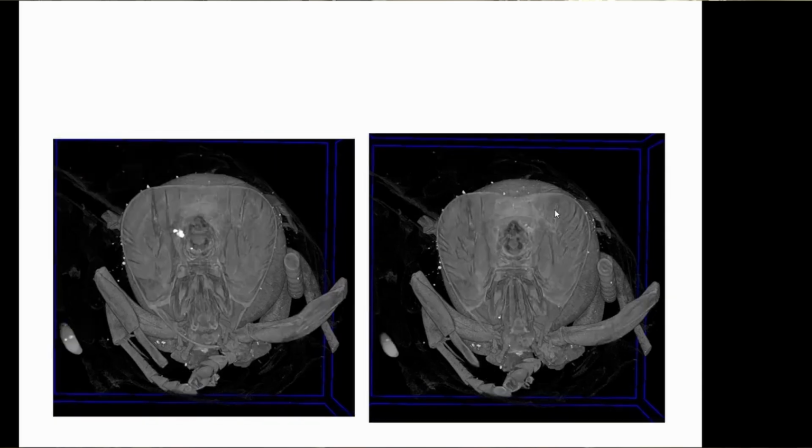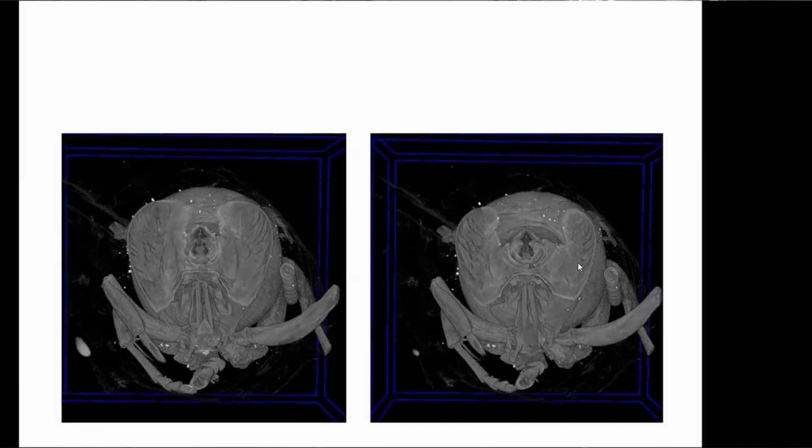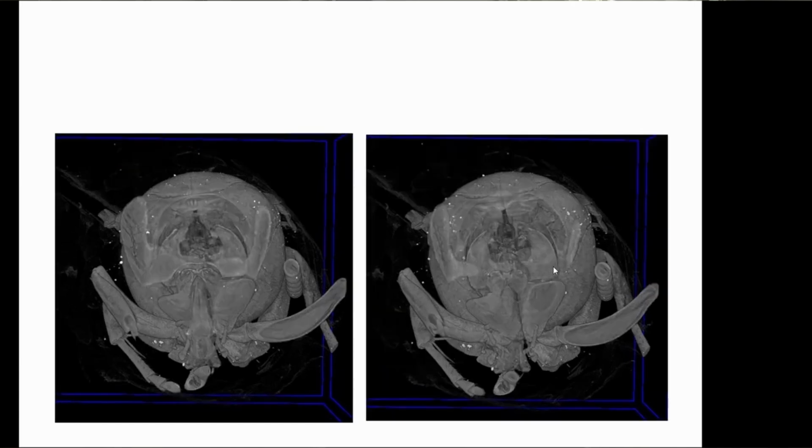I'm going to also be suggesting that there's an abnormal amount of air between the muscle fibers of the adductor muscles to the mandible. Cutting back further still, we're now right at the back of the head, going into the thorax.